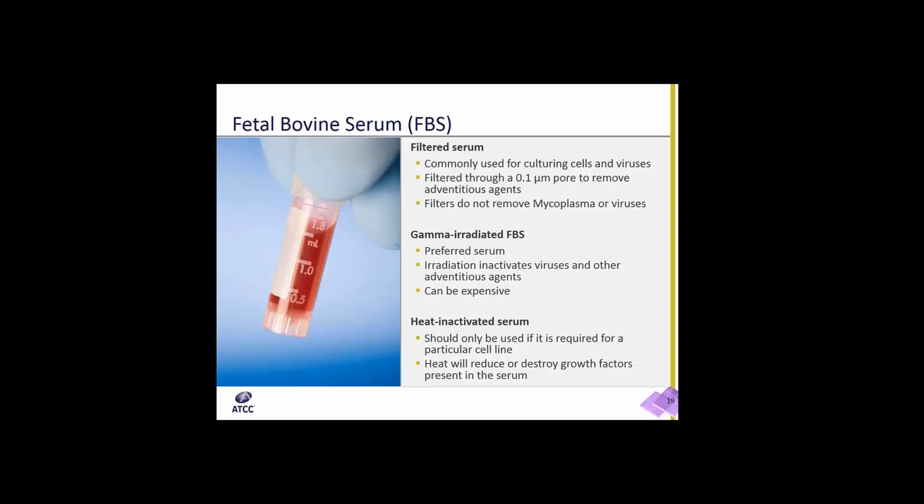Finally, you also have heat inactivated serum. ATCC does not routinely use heat inactivated serum unless specifically required for a particular cell line. Heat inactivation is generally detrimental to the growth of some cells because it reduces or destroys growth factors present in the serum. Originally, heat inactivation was performed to inactivate complement as well as to destroy mycoplasma contaminants. Removal of complement is usually quite unnecessary, but it can be important for certain assays and in cytotoxicity tests.